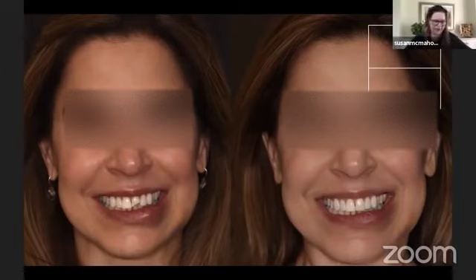So before and after. You see how she's a little whiter on her number 8, and all the rest of her teeth are the same color. And sometimes, like when I look at this case, for so long we were all concerned about that black triangle between 8 and 9, right? And that was there before she had her fracture, and it's there after she had her fracture. I absolutely am not offended by those black triangles at all. I never point them out to patients, and it's really healthier for the teeth if we don't overbuild composite in those areas.